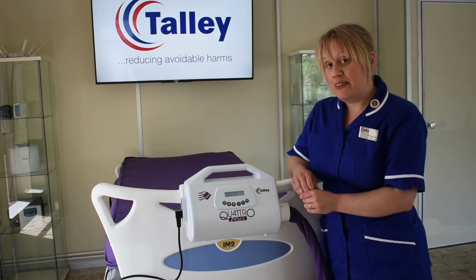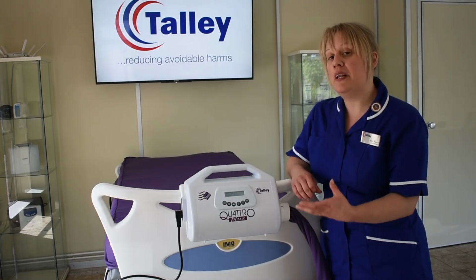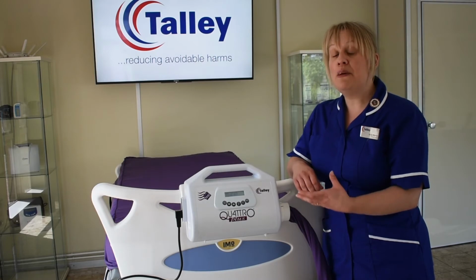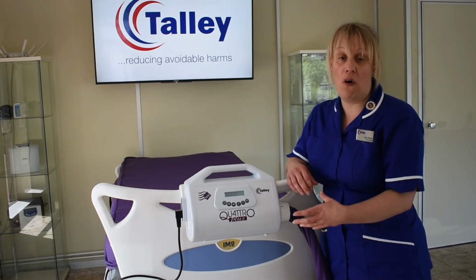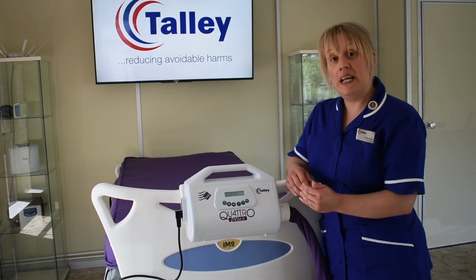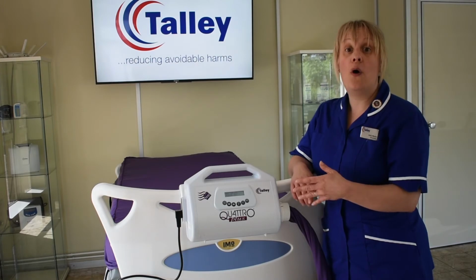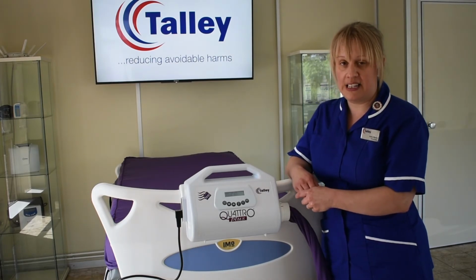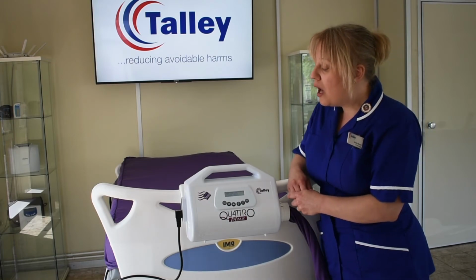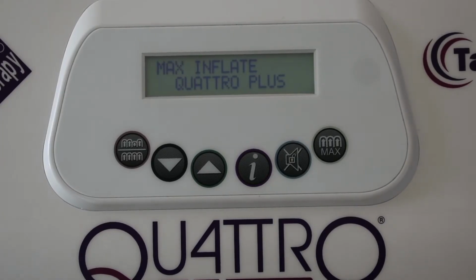Once it's reached max inflate, it will give you 3 beeps, and after those 3 beeps you have 15 minutes worth of max inflate. Now we limit it to 15 minutes because we don't want your patient on that static surface for too long. So after 15 minutes it will automatically go back to active soft, medium or firm, or continuous low pressure, depending on what your patient had it set on previously. So there's your 3 beeps, and we now have 15 minutes worth of max inflate.